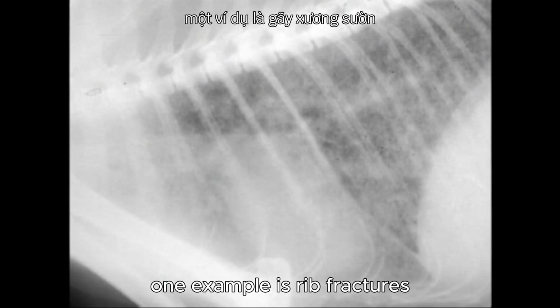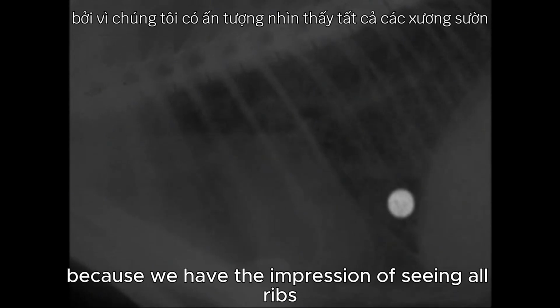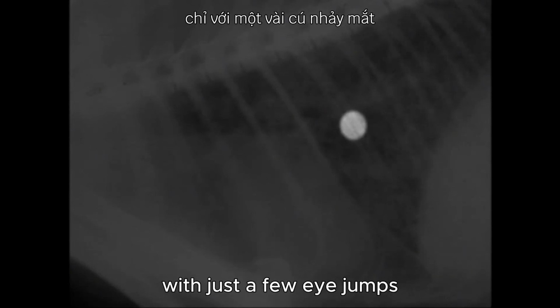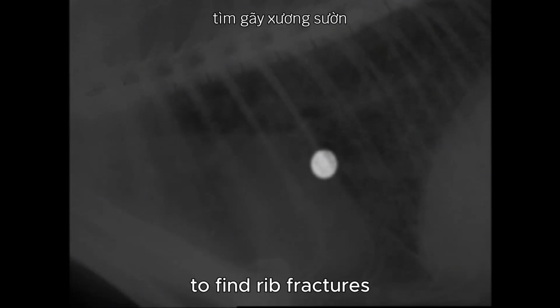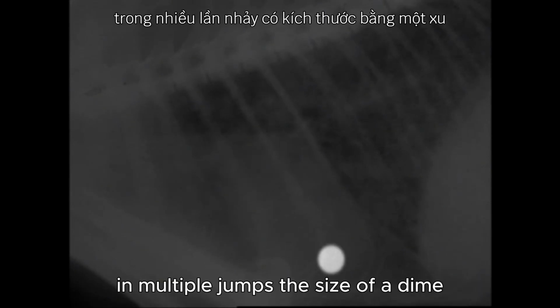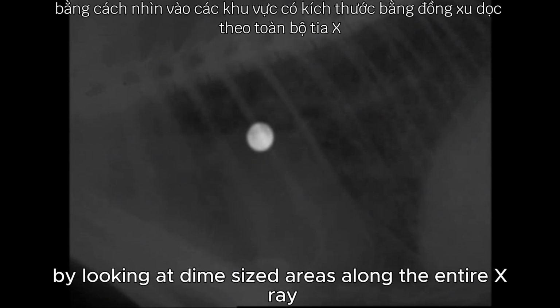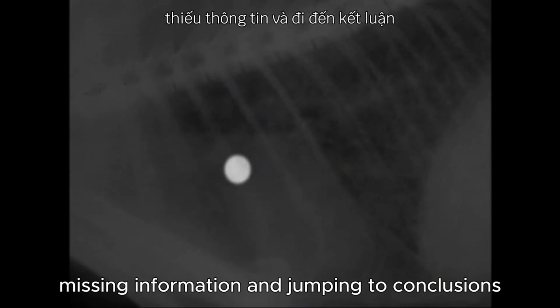One example is rib fractures, which are commonly missed. Because we have the impression of seeing all ribs with just a few eye jumps, most people are satisfied with their search and move on. To find rib fractures, you must look at the entire length of each rib in multiple jumps the size of a dime. By looking at dime-sized areas along the entire X-ray, you will help prevent your brain from filling in missing information and jumping to conclusions.